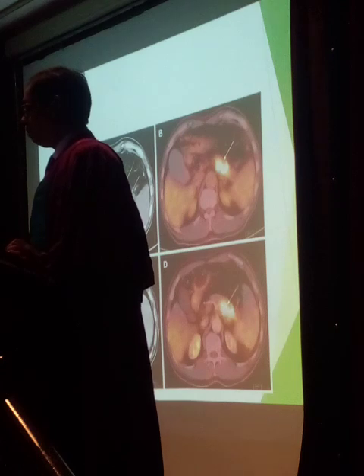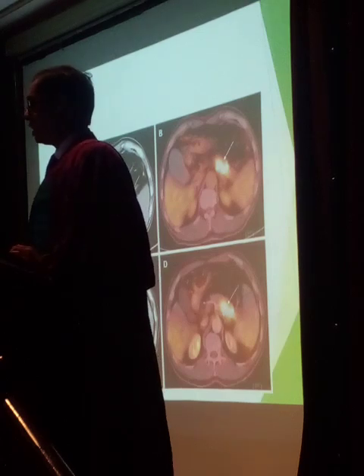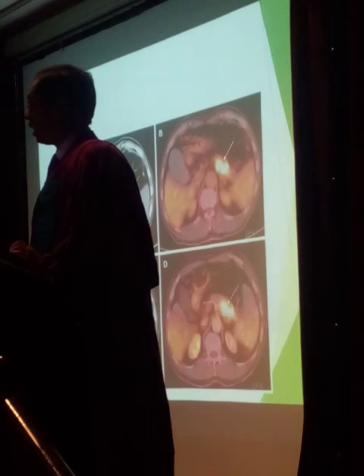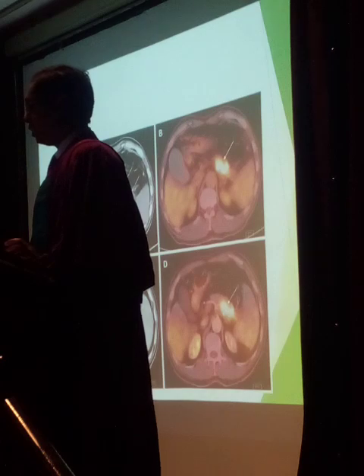If it's a routine follow-up, we can do ultrasound just for screening, and then CT or MRI. Those are the imaging parts. Actually, I don't have slides for the intervention arm because I focus mainly on the imaging part.